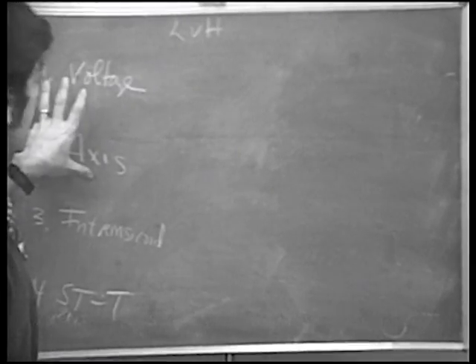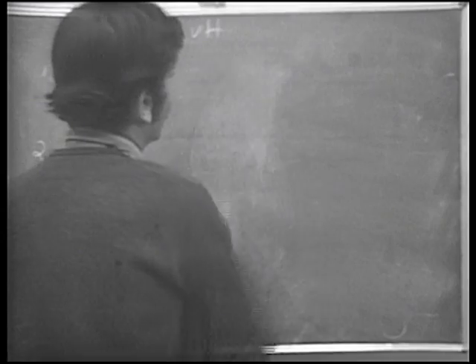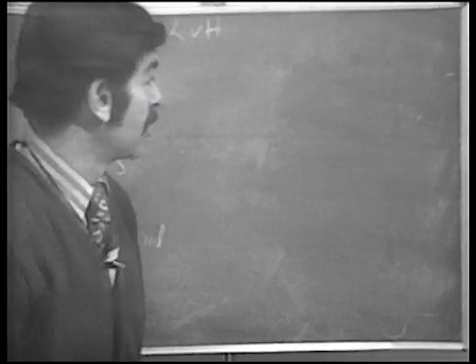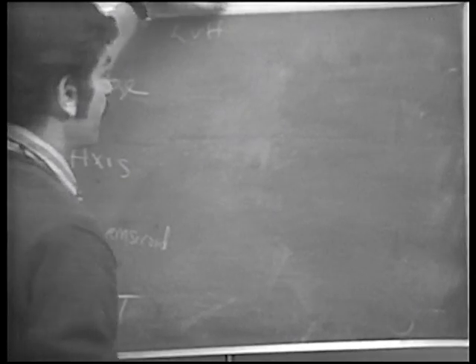Well, let's go on now and say, what are some of the voltage criteria for LVH? If you look in the books, you can probably find at least a dozen criteria. I think it's good to keep a few in mind. And here are some of my favorites. I think they're perhaps not too difficult to remember.